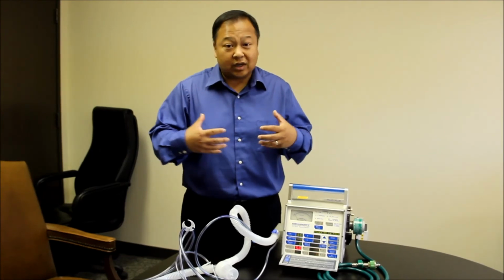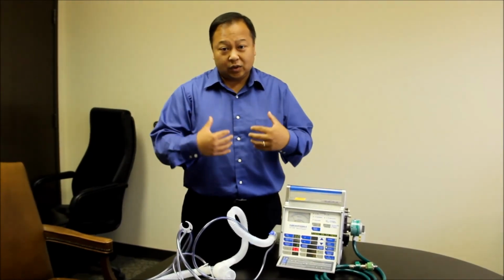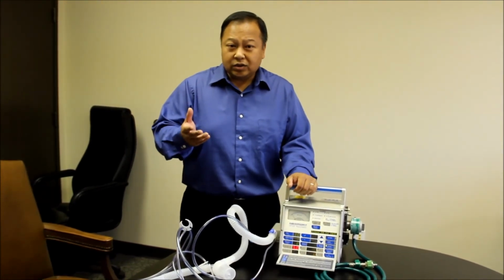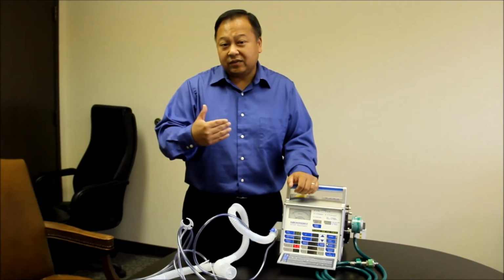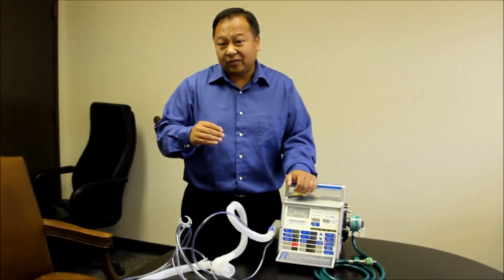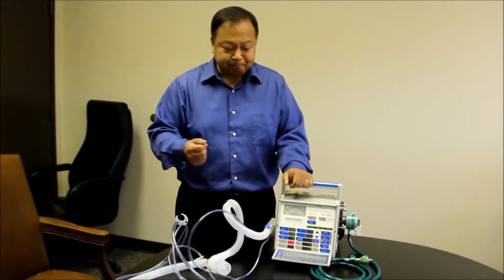Remember, our lungs are like a balloon, so we have to suck in order to bring the air and the oxygen into our lungs. If a patient cannot do that, then they're not ready to be extubated. And usually the negative inspiratory force that we measure, if they get about minus 25 pressure, then that's another good criterion that they're ready to be extubated.